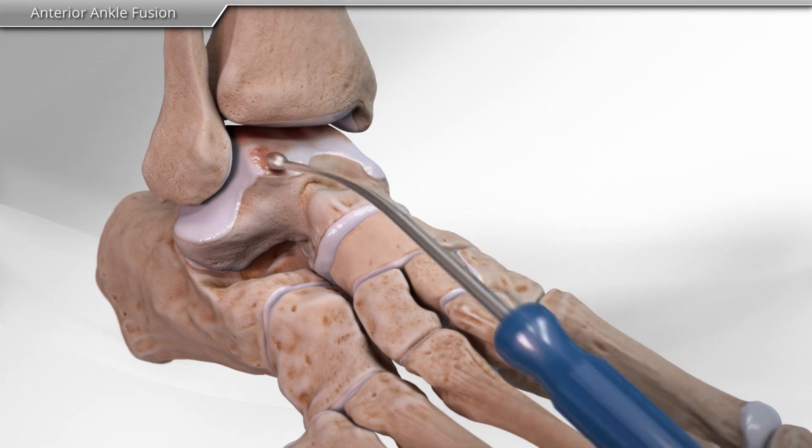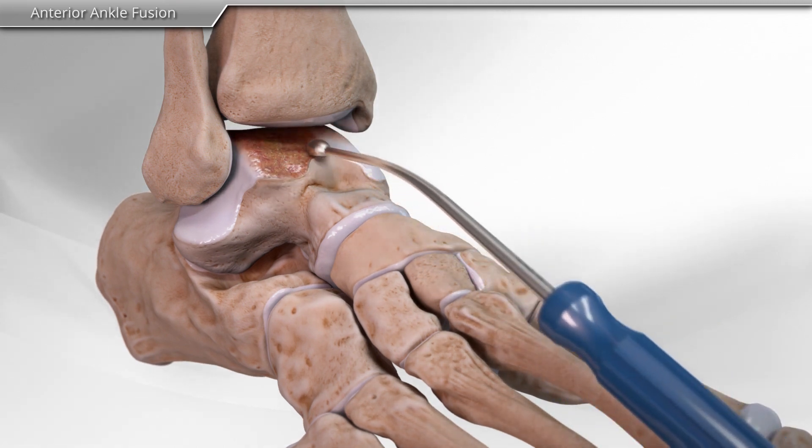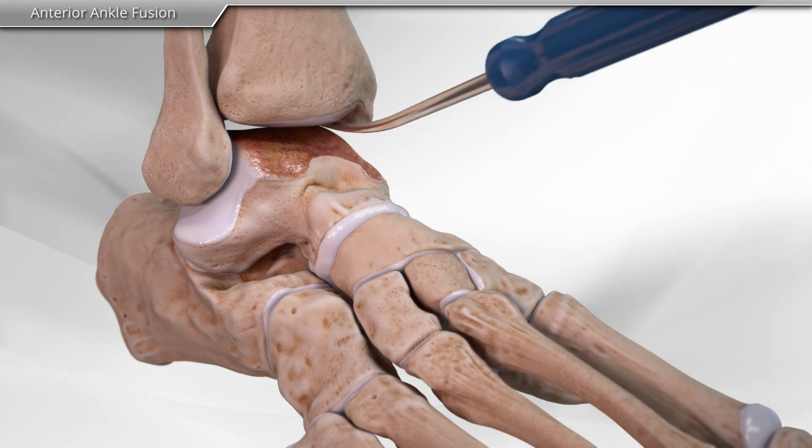To begin, your surgeon makes an incision. Next, instruments are used to remove the damaged cartilage from the joint surfaces.